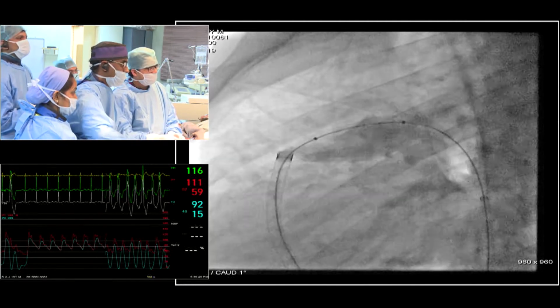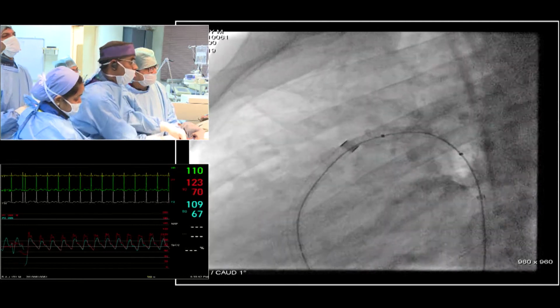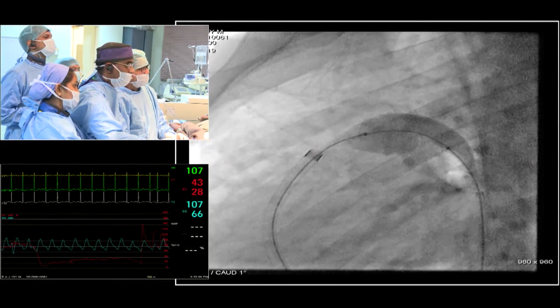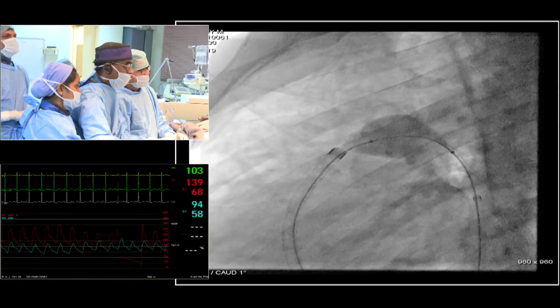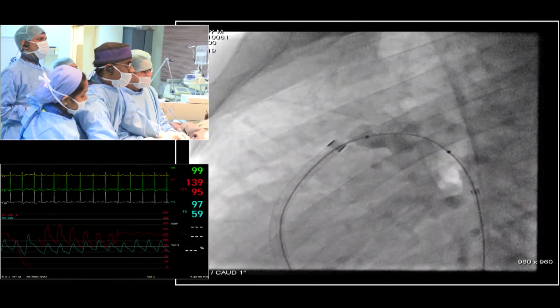You should keep your hands there itself. Pull. Okay. You'll hold it. Don't take your hands out. A little bit more pull. A little bit more. Relax, relax.